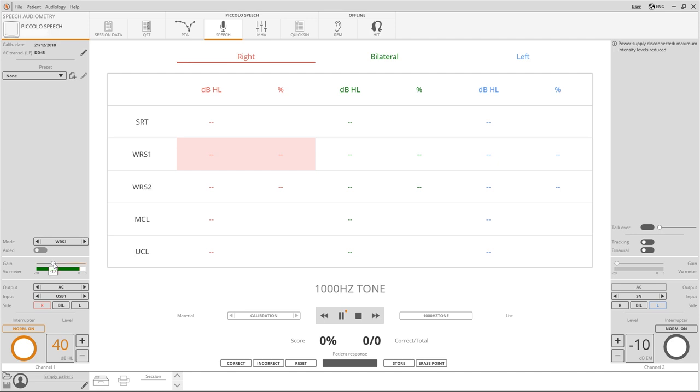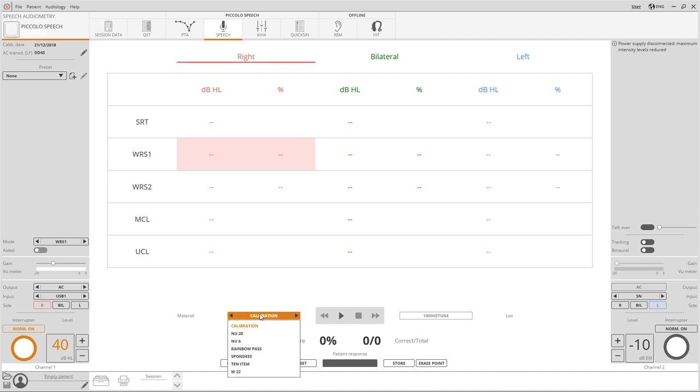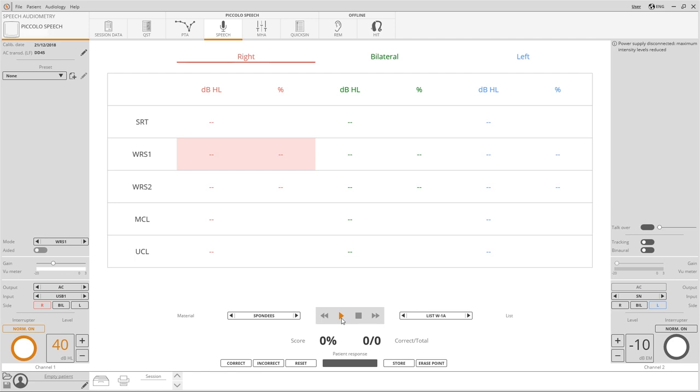Ideally the VU meter will reach the value of zero. When this is done we can proceed with the examination. In case you're working with material stored on the computer, playback can be started by pressing the play pause button.